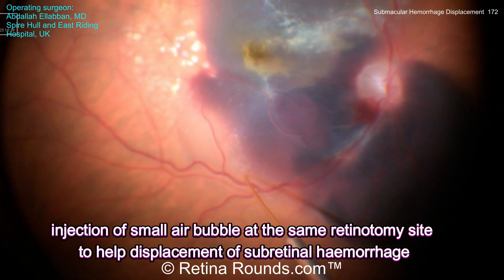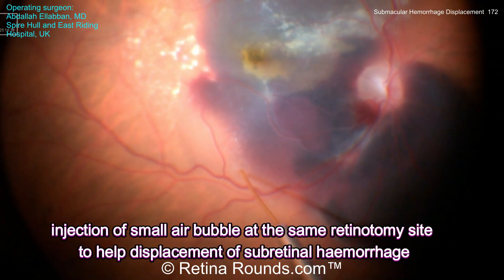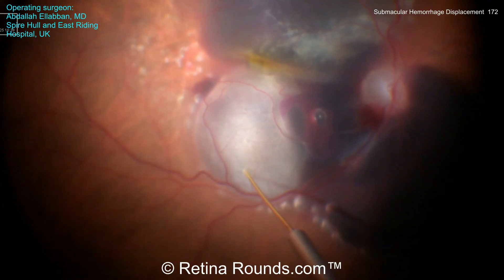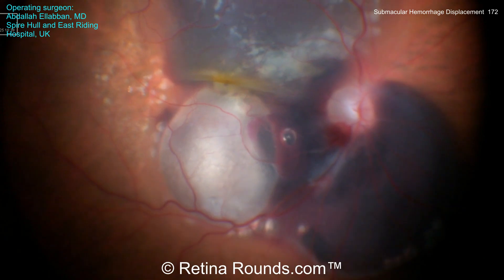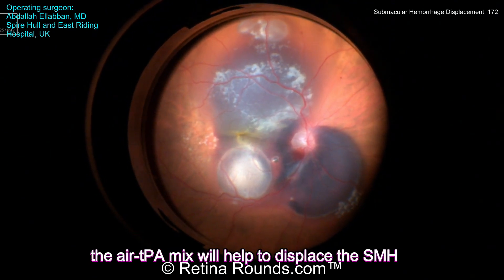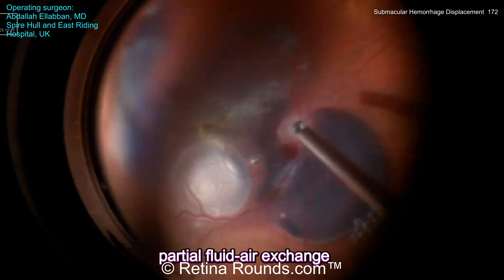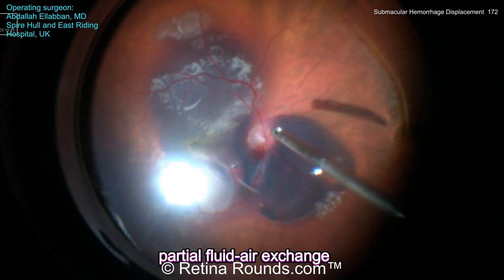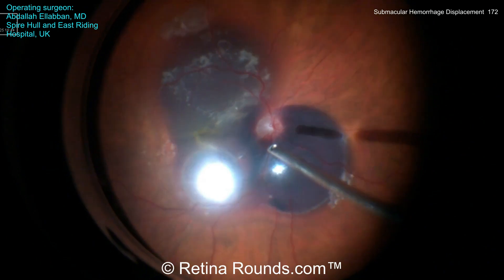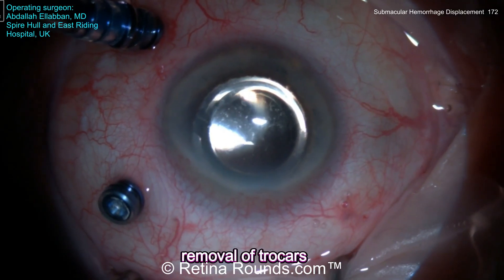Dr. El-Aban is now going to inject a little bit of submacular air, going through the same area where he injected previously, and very slowly administering some air into the submacular space. The reason for the air bubble is, A, to create a little bit of an air plug so that the TPA in the subretinal space doesn't egress through the retinotomy, and also the buoyancy of the air bubble allows for compression of the TPA against the hemorrhage and allows for some pneumatic displacement of the hemorrhage inferiorly if the patient's in the upright position. Once that submacular injection is done, Dr. El-Aban performs a partial air-fluid exchange — typically anywhere from a half to a third of the vitreous cavity — and then inspects the area to confirm bleb height and air bubble position.